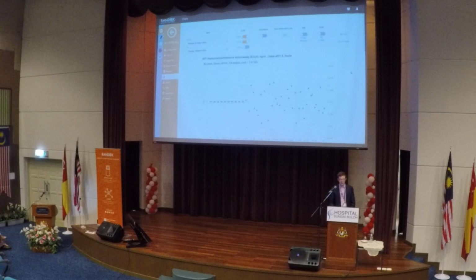Okay, so that is our Levey-Jennings charts. These Levey-Jennings charts can be printed or can be saved as a PDF. I know that some labs will print out their charts on a weekly basis, some will do it on a monthly basis. This can be done at any time on demand. So the next chart we're going to look at is our histogram chart. We're just going to combine that and then generate.